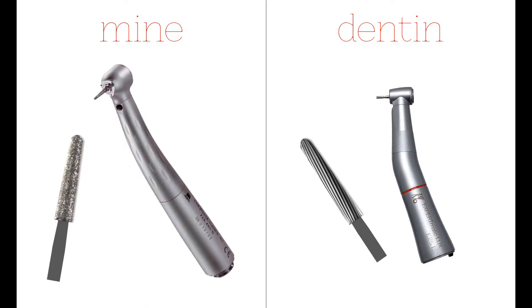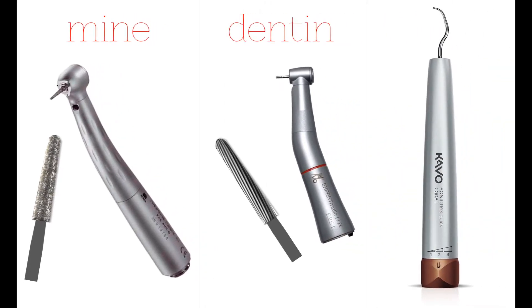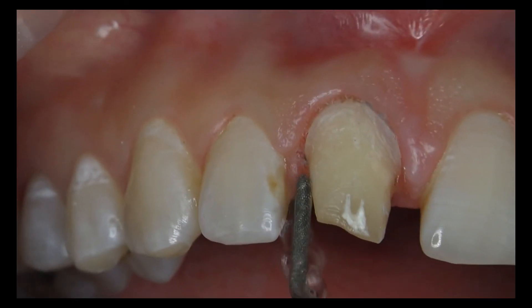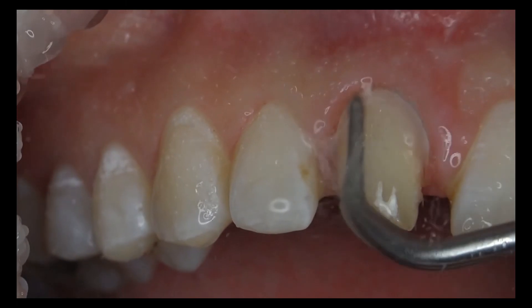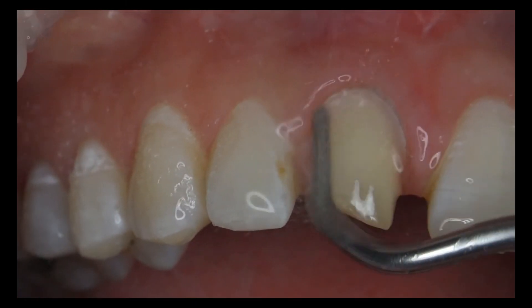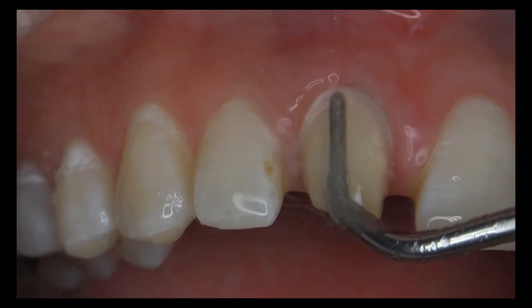The temporary retraction period resulting from the vasoconstricting astringent is approximately 10 minutes. In other words, we have 10 minutes for the margin preparation. We will prepare the margin line with sonic burrs that do not harm or bleed the tissue, since we will penetrate only 0.5 mm into the gingiva. A 0.8 mm chamfer type margin will be prepared since a translucent zirconia framework will be used.